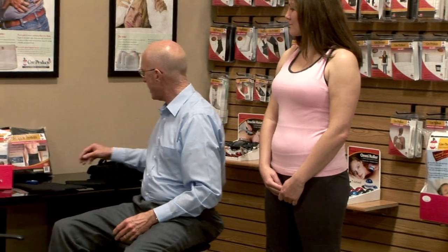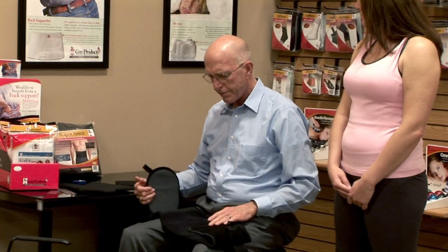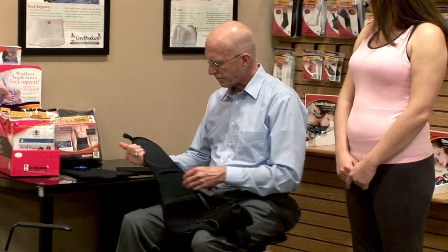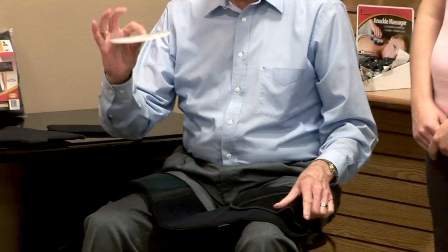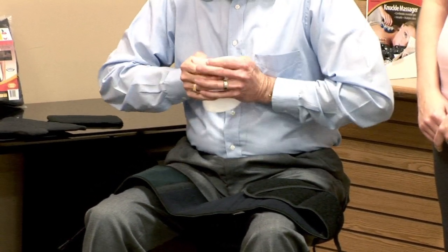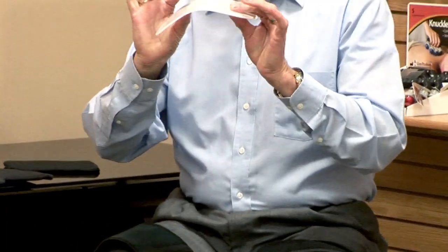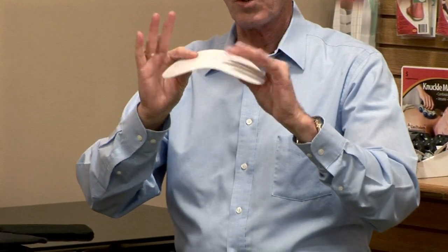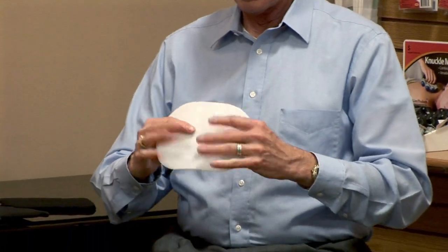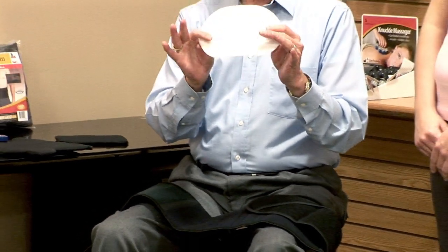So we have our measurements and documentation, and we have the right size device. Before we actually fit the device, the plastic rigid panels come just flat, so you can shape them a little bit by overbending and contouring them. If you overbend them a little bit, they'll spring back but retain some shape. Instead of a flat panel, now we have a device that contours to the patient's tummy, which will be a lot more comfortable for them.